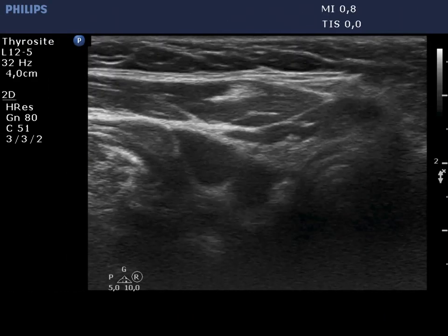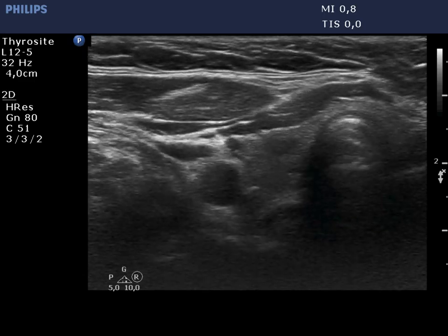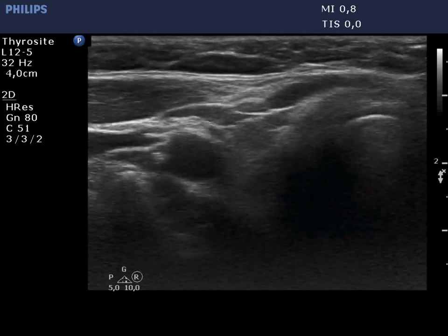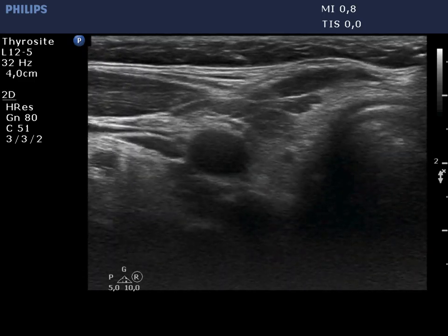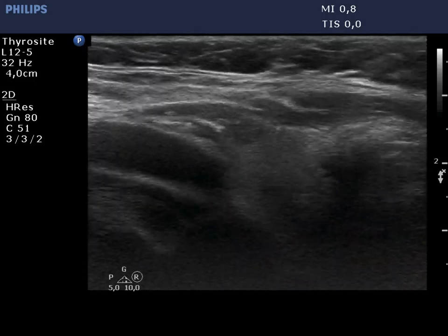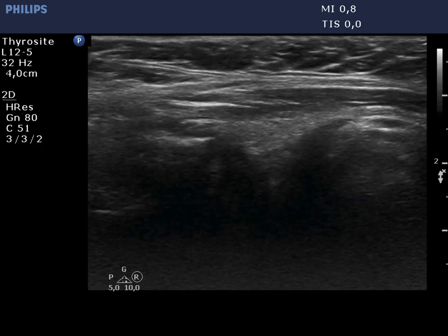The right lobe is echonormal and has several hypoechogenic areas. The lower one has one punctate echogenic focus.